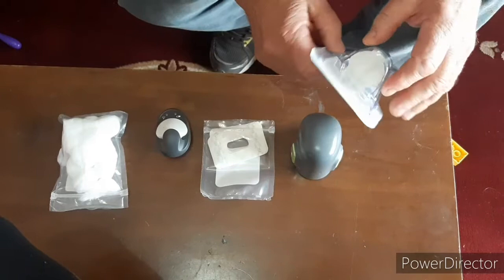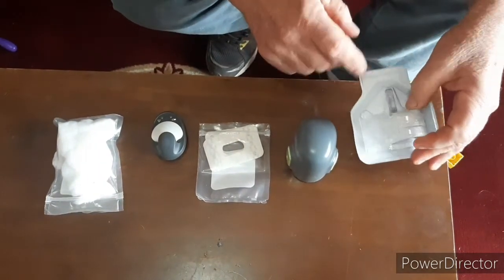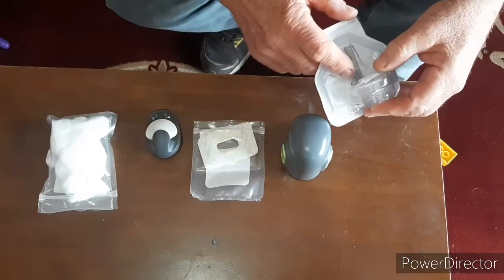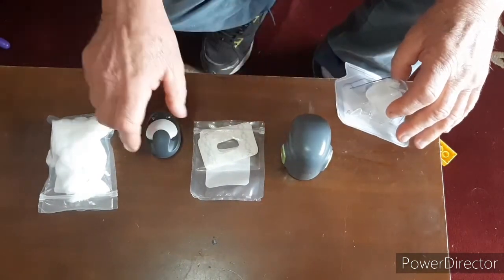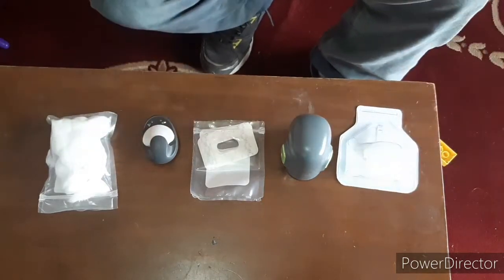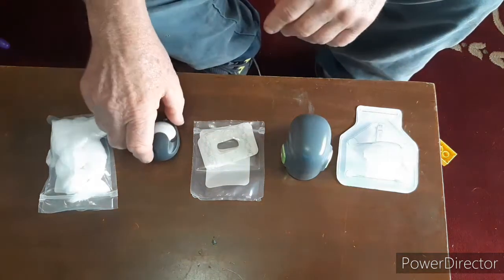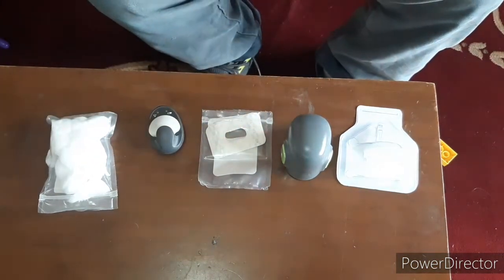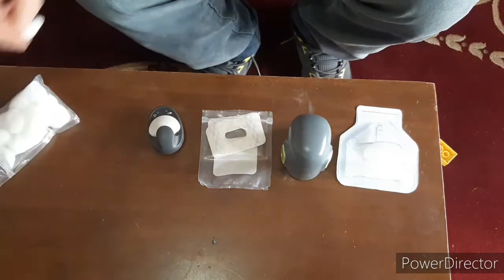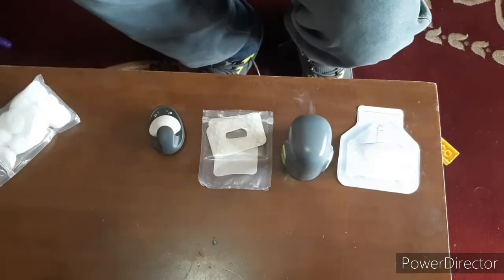These are the standard hardware items that go beneath the skin and sit on the top, housing the sensor. The first step is just to clean off the site.